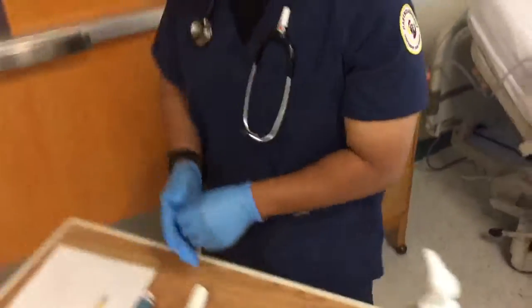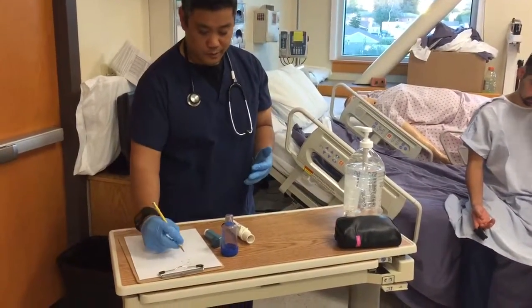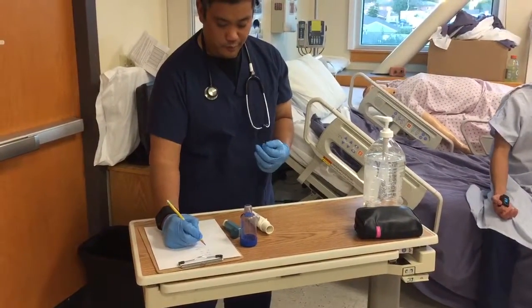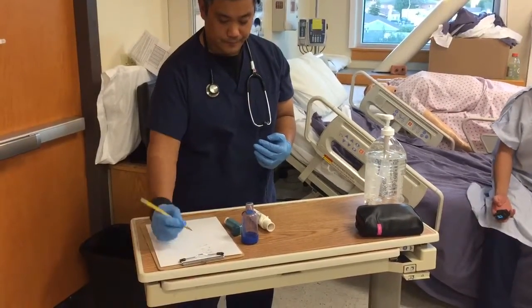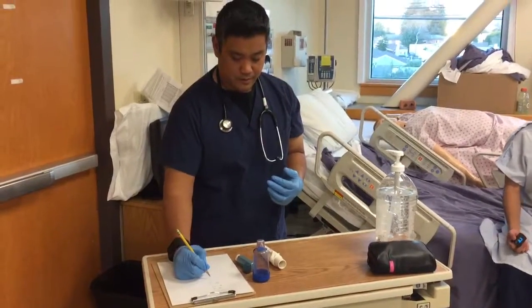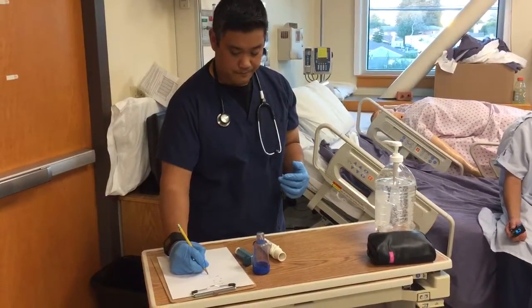So I've got a pulse of 32 in 30 seconds. We'll multiply it by two, so we got 64. Respiratory rate of 7 in 30 seconds, I got 14. Multiply that by 2. And we got a saturation of 98, which is very good.